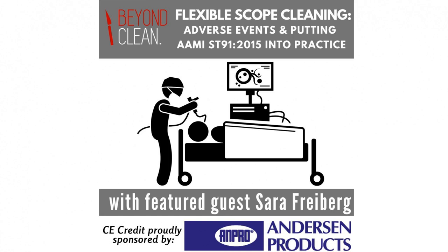I have seen borescopes used in some facilities. Several methods can be used to evaluate the results of the cleaning process. And from a patient safety perspective, all guidelines recommend the importance of inspecting the endoscope prior to, during, and following patient procedures. That includes visual inspections. For example, when users are performing a leak test, taking at least 30 seconds to do a complete visual inspection of the endoscope. We recommend a light above the sink area, as well as a 10 times lighted magnification for deeper inspections.